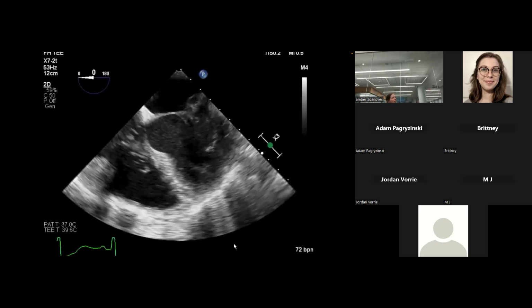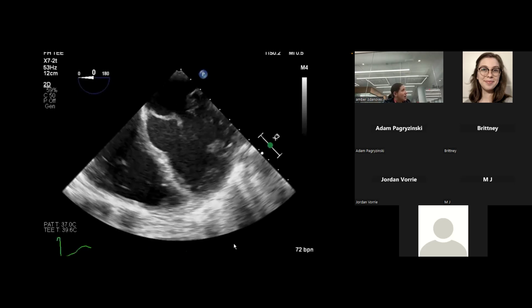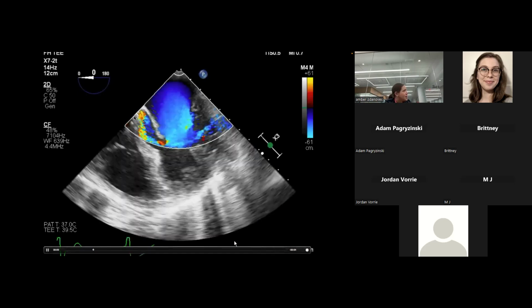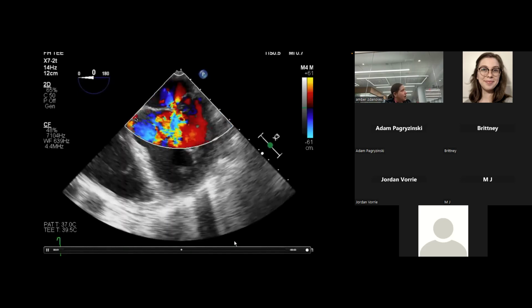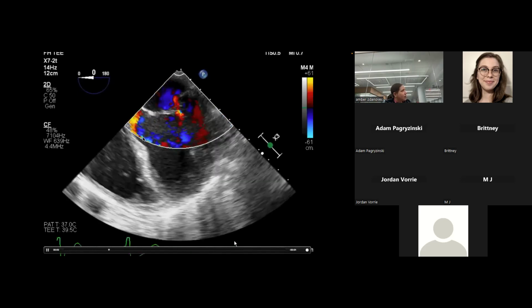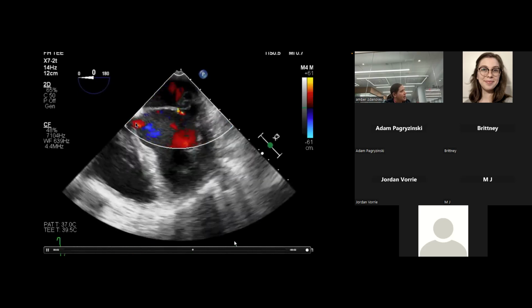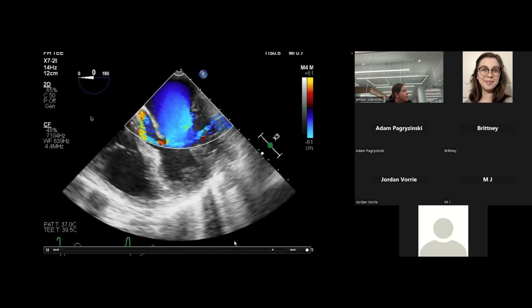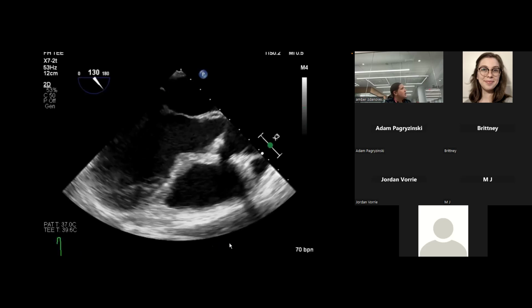This is our 4-chamber view here. And I took these pictures, so I always do a very systematic thing when I get pictures. All right. So we'll look for some MR. What do we see kind of sneaking into view here? Yep. So this is your LVOT. And what would that turbulent flow coming in the LVOT be? It looks like during diastole. Regurg, yeah. So we know this guy has AS, but it looks like he might also have some regurg.